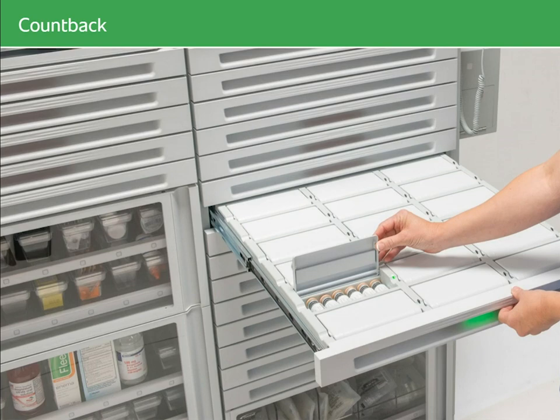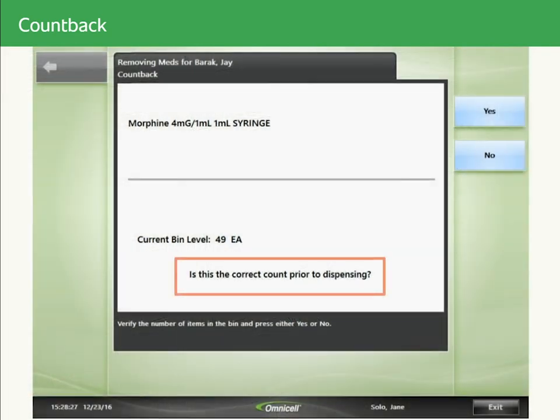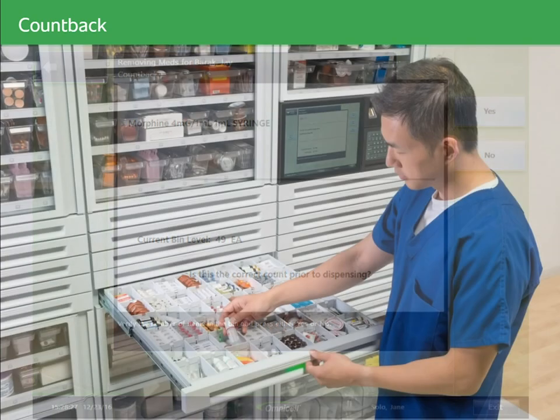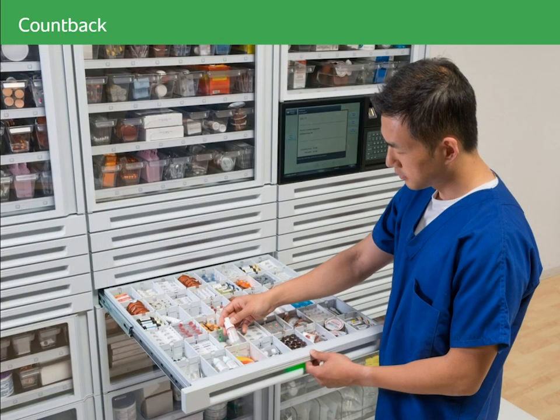You may be required to verify the quantity of items in a bin when removing or returning medications. The system normally prompts you to verify a count on narcotics when an amount is in question or to resolve a discrepancy. You may also be required to do a blind count, in which case the system will not show you the expected quantity. Other times you may do a normal count and the expected quantity will display. This option is configured according to your facility's policies. Upon opening a drawer, Color Touch may also prompt you to count another medication in the same drawer — this may happen if a narcotic is placed in a lower security drawer due to space limitations.